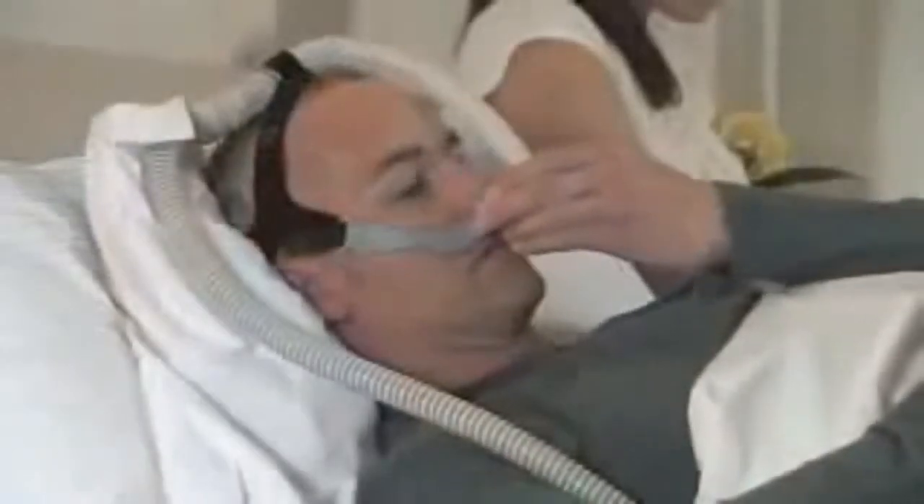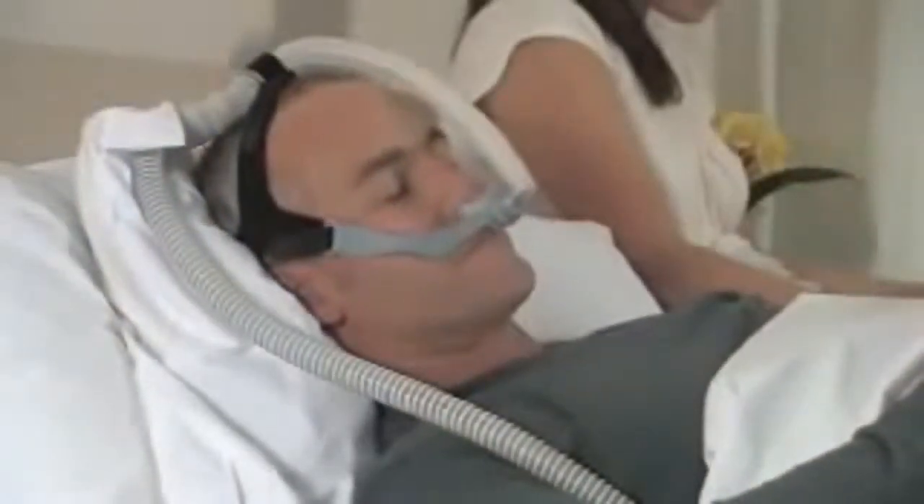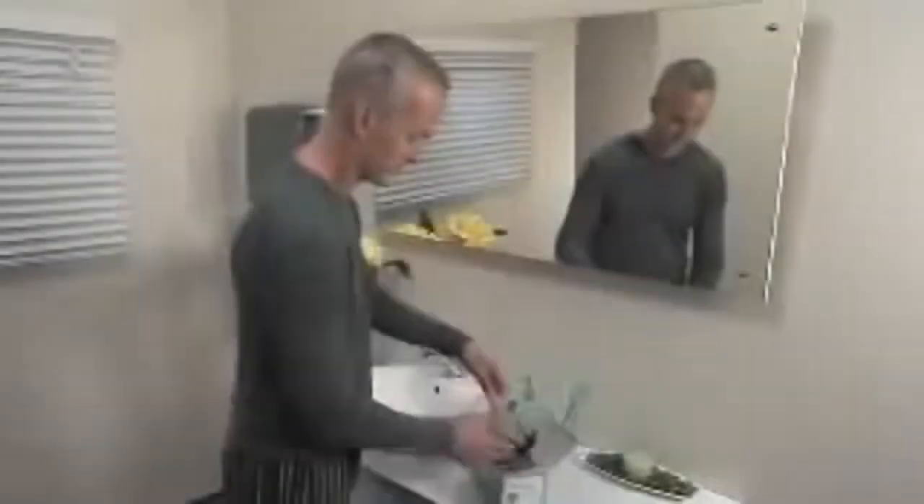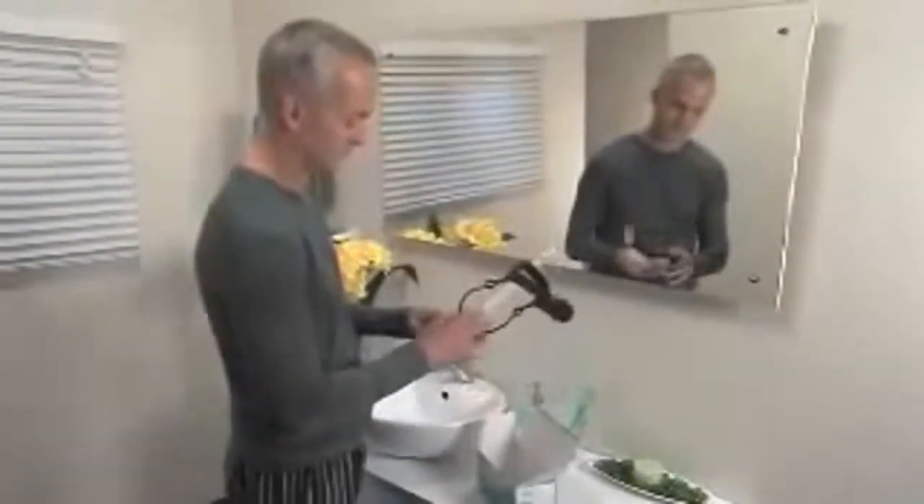Your Opus 360 Nasal Pillows Mask is quiet and superbly comfortable to offer you total sleeping freedom. Your mask comes assembled, ready for use.